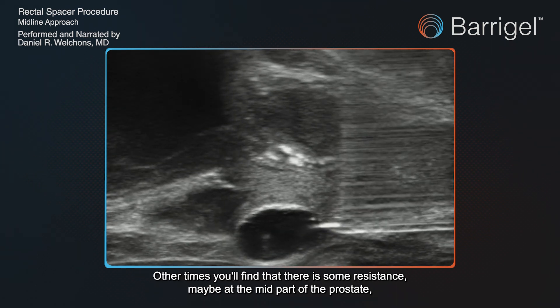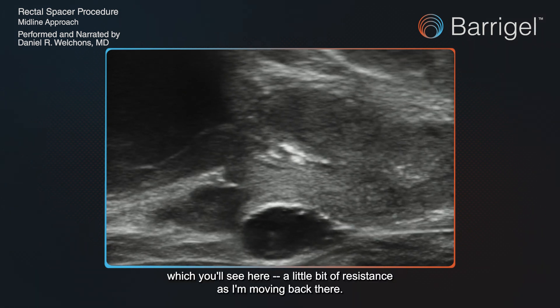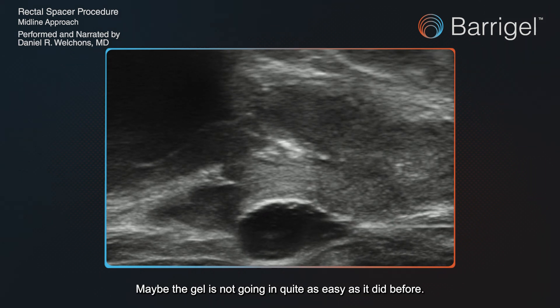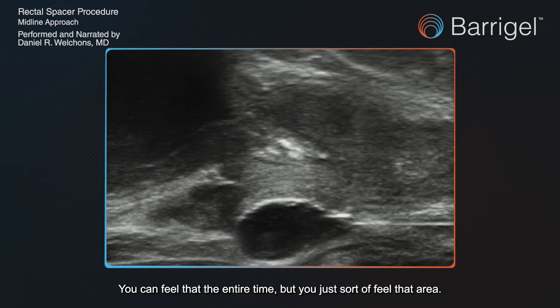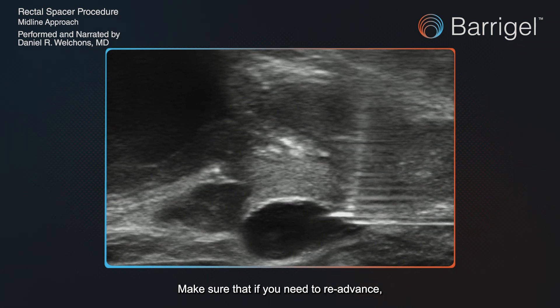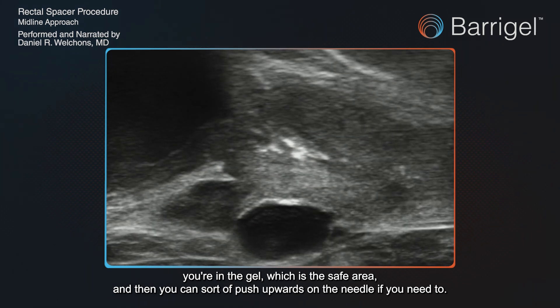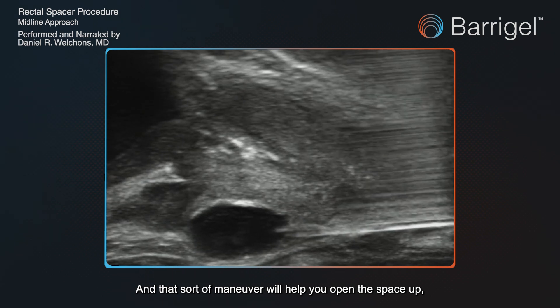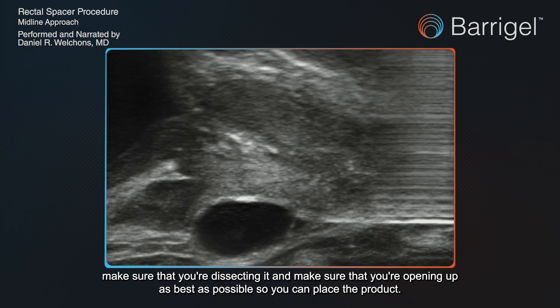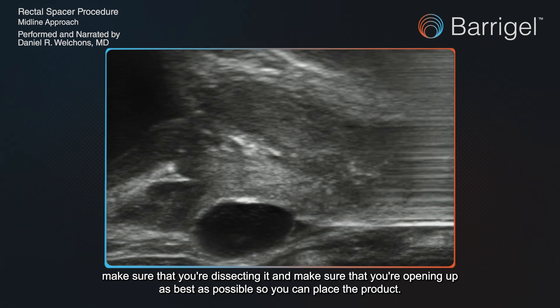Other times you'll find there's some resistance, maybe at the mid part of the prostate — you'll see a little bit of resistance as I'm moving back here. Maybe the gel's not going in quite as easily as it did before. You just feel that area, and if you need to re-advance, make sure you're in the gel, which is the safe area. You can push upwards on the needle to open the space up and ensure you're dissecting it as best as possible to place the product.